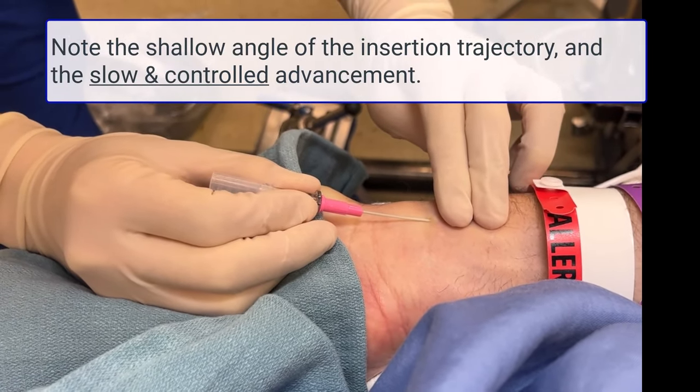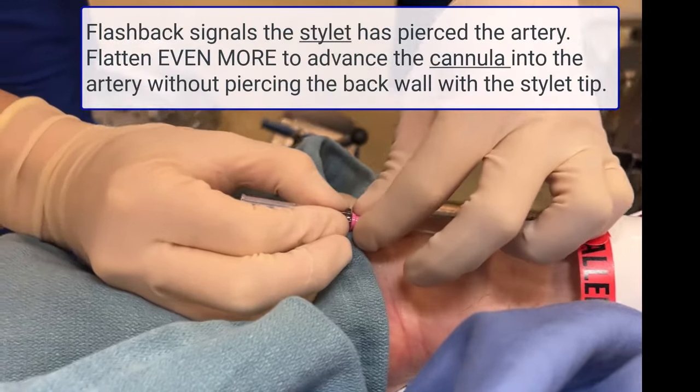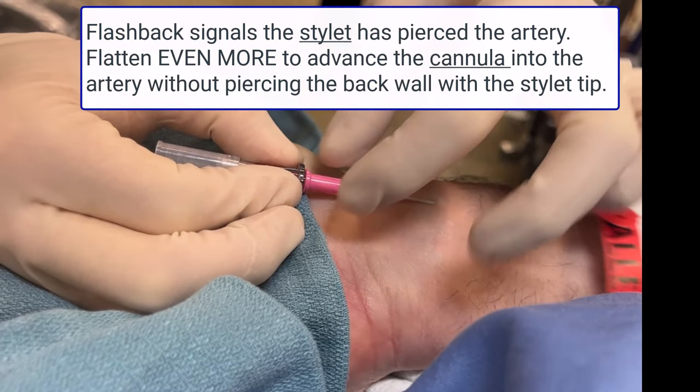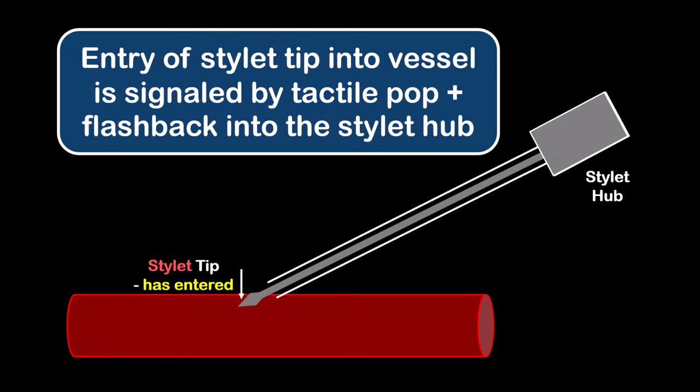Arterial puncture by the stylet is signaled by a tactile pop and flashback of blood into the stylet hub. Flatten the trajectory even more, parallel to the surface of the wrist, before advancing the cannula one to two millimeters forward to bring the cannula tip into the artery. You must verify that the cannula tip is lying within the arterial lumen before trying to advance it off the stylet. Remember that flashback into the hub only means that the stylet tip has entered the artery — it does not mean that the cannula tip is necessarily within the lumen.